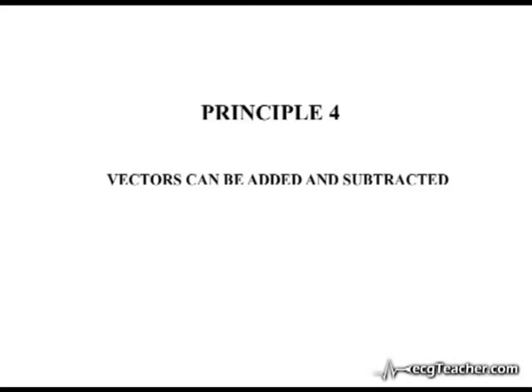In the simple model shown here, an ECG lead is facing two pieces of ventricular myocardium of different mass and differing patterns of depolarization. The lead analyzes depolarization in the plane of the screen. The two pieces of myocardium depolarize at exactly the same time.